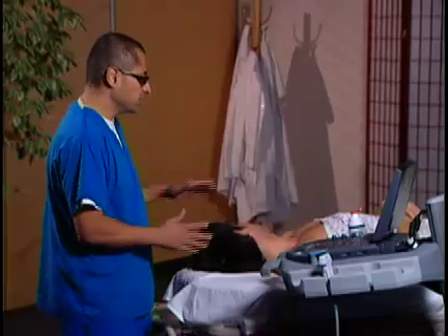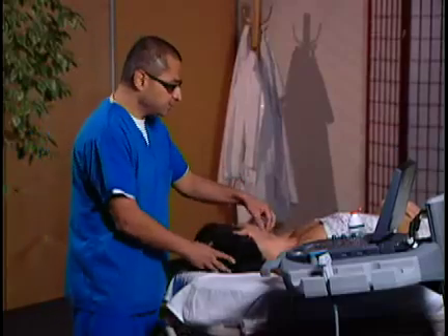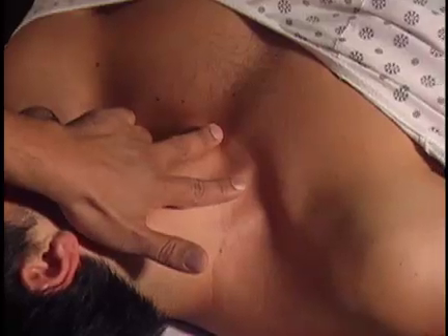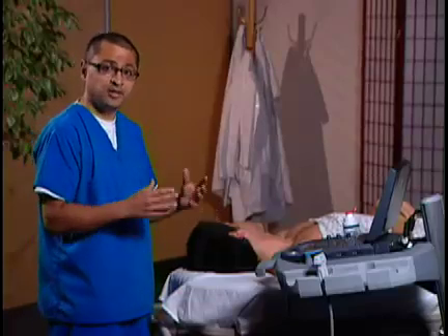Let me show you how we'll position our ultrasound. We have our model here lying down. Normally we'll be at the head of the bed. If you look at his neck, you can actually see the two heads of the sternocleidomastoid — a sternal head and a clavicular head that usually form a triangle. Normally in a blind landmark approach, our needle will be going to the apex of the triangle. We're now going to use ultrasound to localize the vein and make the needle insertion so much safer.